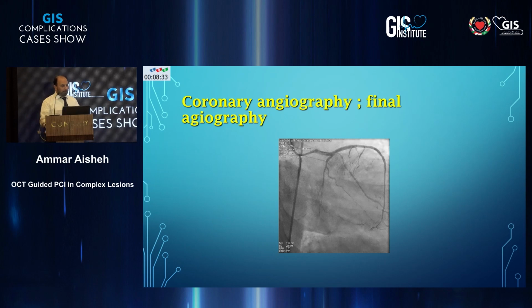I'm not going to change the topic, but what makes you stent the lesion if you believe in that? You believe in DCB. Yes, thank you. This is absolutely important because all of us have been trained to see that perfect angiographic appearance, the cosmetic effect. You have to learn when you're using a drug-eluting balloon, that's not going to be the case. It's the functionality and the flow in the artery. It's not going to look perfect. As long as it's functional and there is TIMI 3 flow, the outcome is very good.